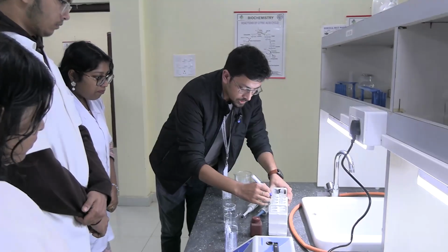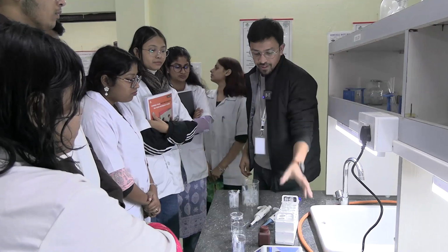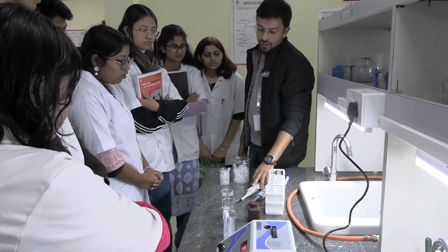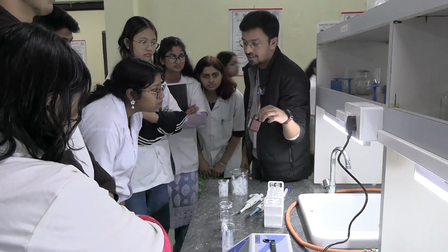3 test tubes, mark them with B, S and T. Let's say this is B, S and T. We have taken 3 test tubes. Okay, this is blank, standard and test. What we will do, first we will add 1 ml of enzyme reagent. Which one is the enzyme reagent? This is the enzyme reagent.